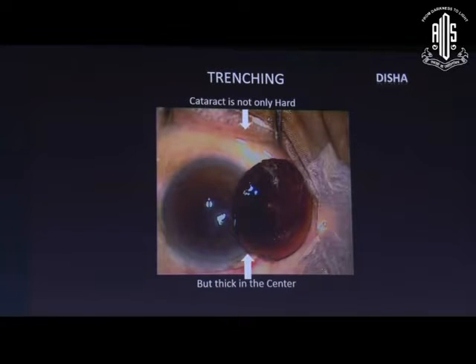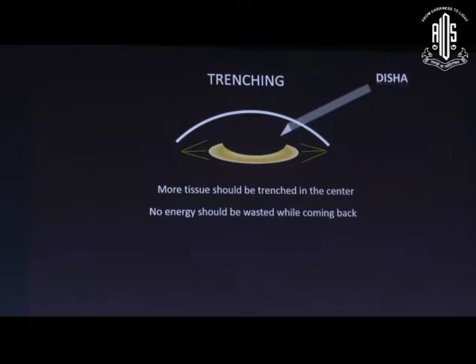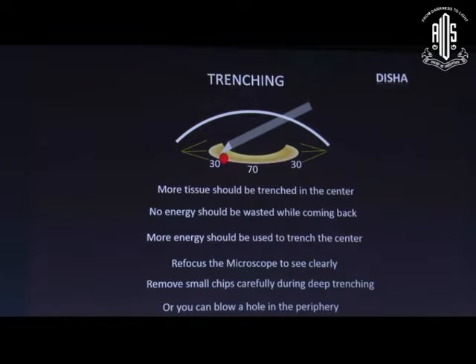The nucleus is harder and thicker in the center, so more tissue needs to be trenched there. When coming back, no energy should be wasted — more energy should be used during trenching in the center. Every time we need to refocus the microscope to see clearly during deep trenching; otherwise we may create a hole in the posterior capsule. During deep trenching we need to remove small chips very carefully.